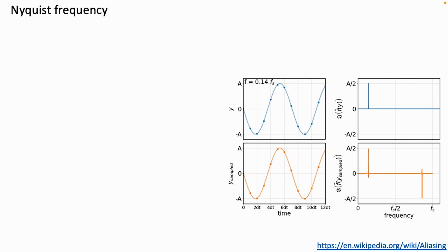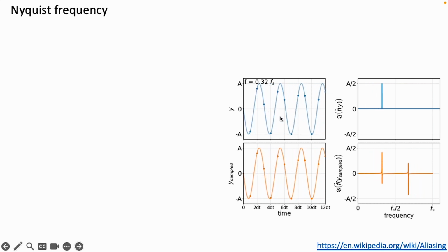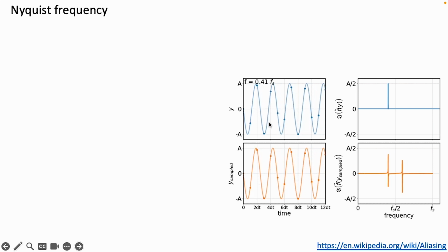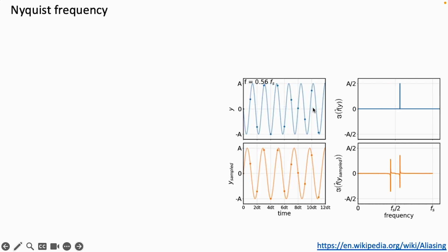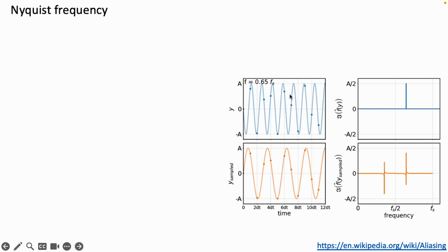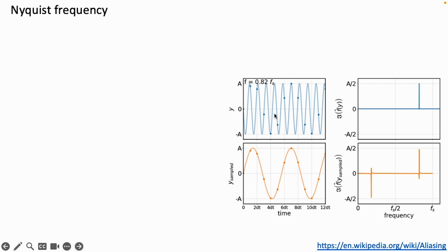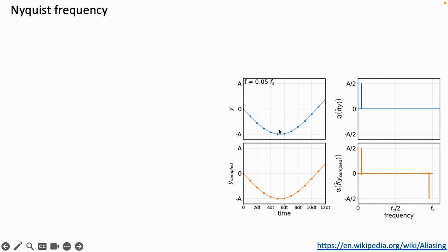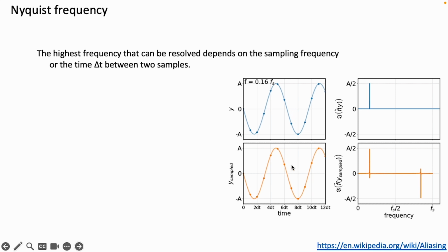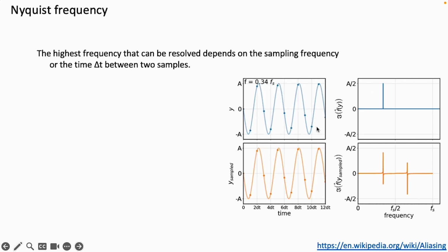And initially, the EEG is nicely captured, but if you just look at the points over here, then at a certain point, the points start showing weird patterns. And these weird patterns cannot really be distinguished from one another. So the frequency that you see here, and I'm not sure whether I can stop it actually. I was hoping that I could stop it. No, I cannot stop it. But let's just wait a little bit.